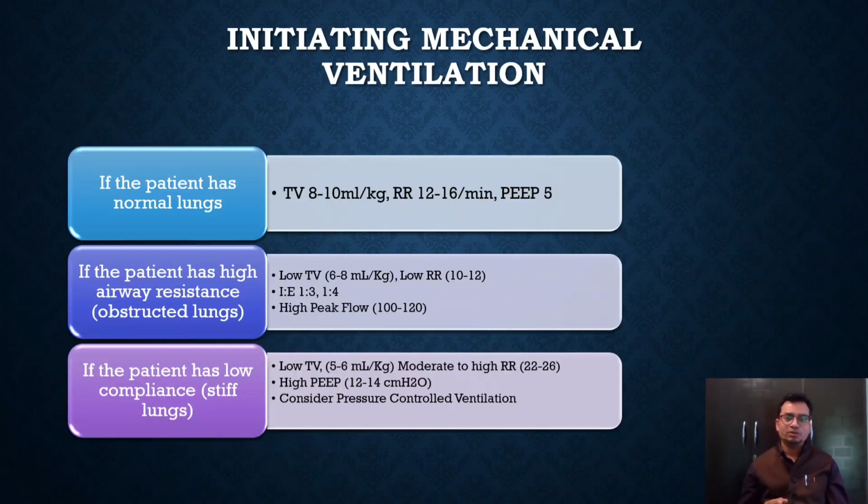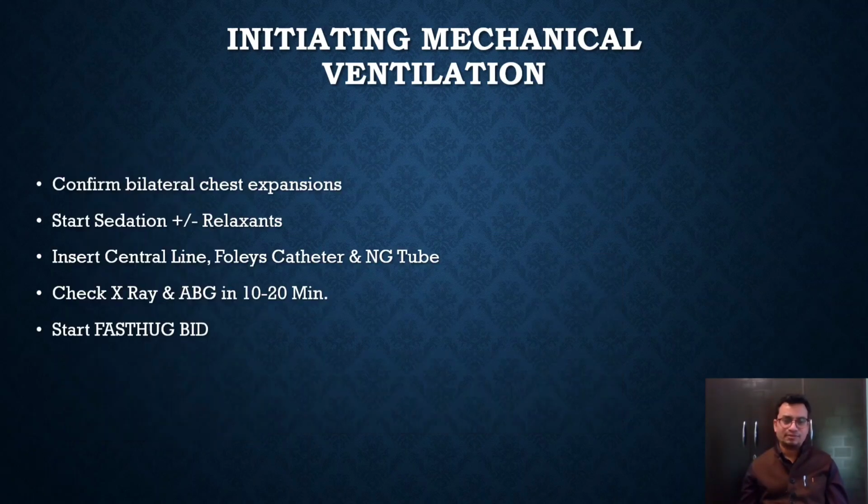I told you the standard settings which you will set on mechanical ventilation in a normal patient. However, in those with obstructed lungs or in those with stiff lungs, the settings on mechanical ventilation will be totally different. Like pressure control or APRV mode may be better in stiff lungs. So we will discuss it more in the next few slides.